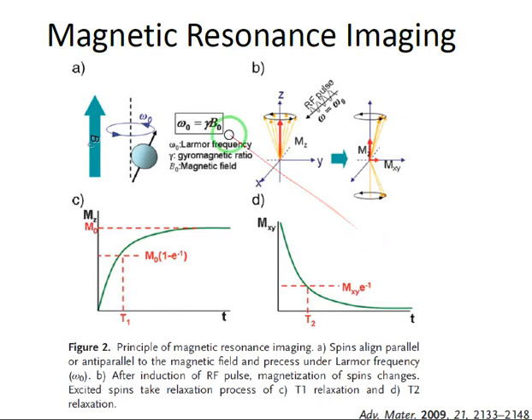Hi everybody, in this video we want to talk about the concepts of magnetic resonance imaging and get familiar with these curves and these schematics. Well, the MRI technique is based on applying an external magnetic field and also a radio frequency wave.